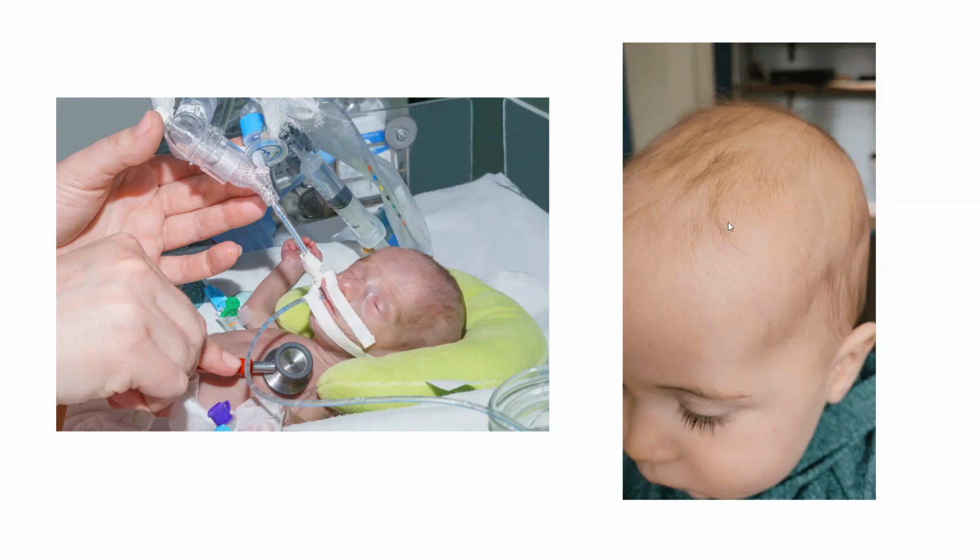You might have to adjust your focus again, depending on where you want to image. Do you want to see the superficial areas of the brain first? Do you want to see the deeper areas of the brain? There's a whole chapter on assessment of brain imaging, which gives you a step-by-step approach of how best to do this. Any questions about this?